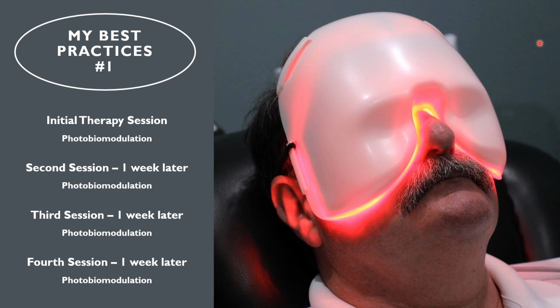So, hypothetical best practices number one. We would have an initial therapy session. That's the terminology of photobiomodulation. So I put the mask on. We have a 15-minute exposure time. Get up and go home. You come back a week later, put the mask on, and we get people to wash their face if they've got makeup or anything on. Most men, we don't have to worry about it, but you don't want any makeup or stuff on.